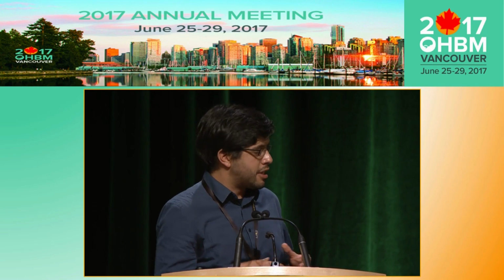Well, thank you for your question. A STEAM sequence for our study and our perspective has one of the advantages that, as I described before, the model is simple enough to analyze. And second, the fact that we are using ex vivo samples, the parameters like T1 and T2 get completely reduced.